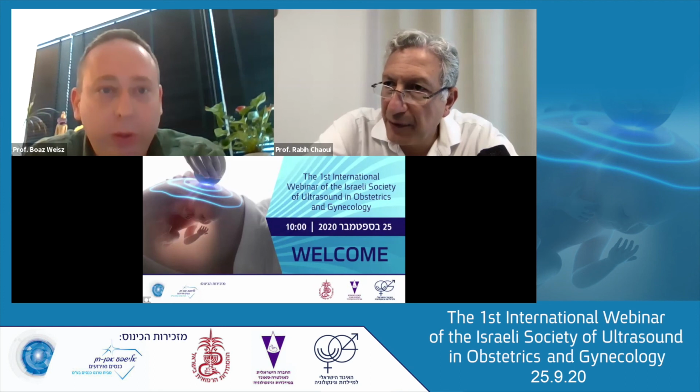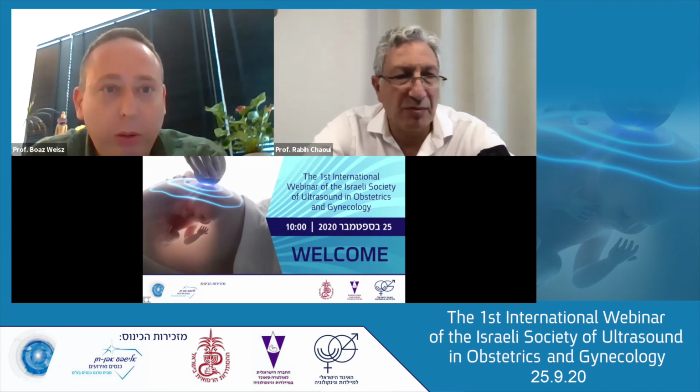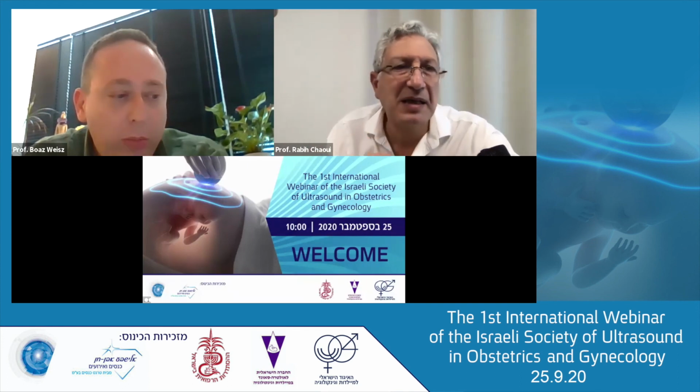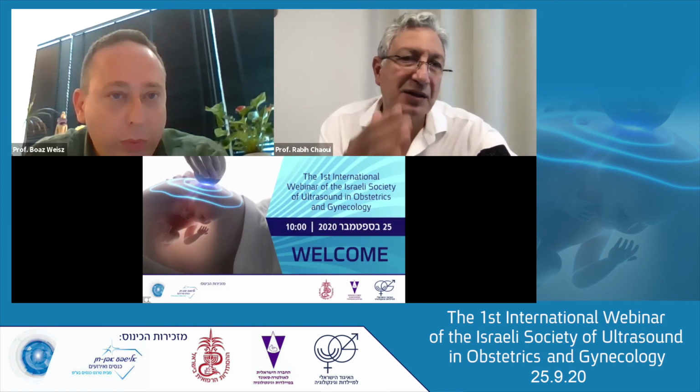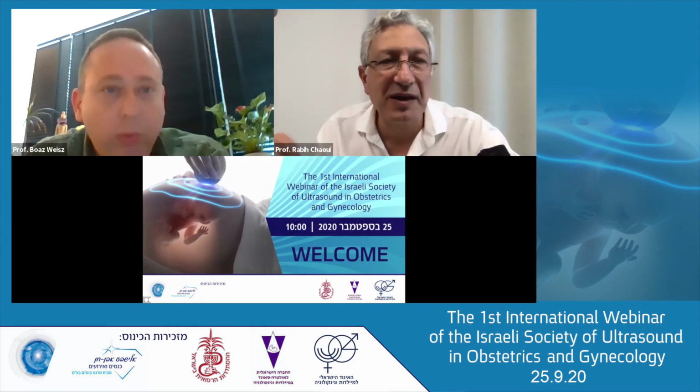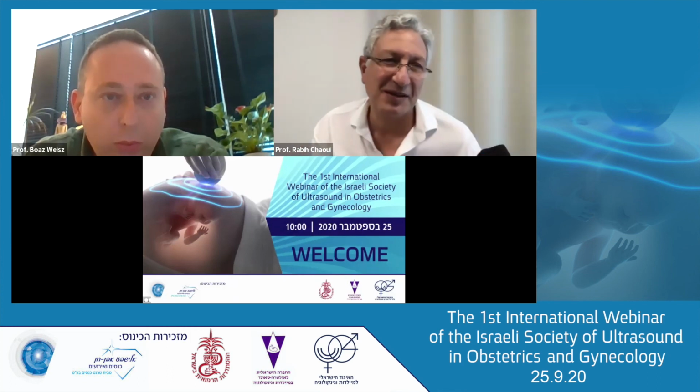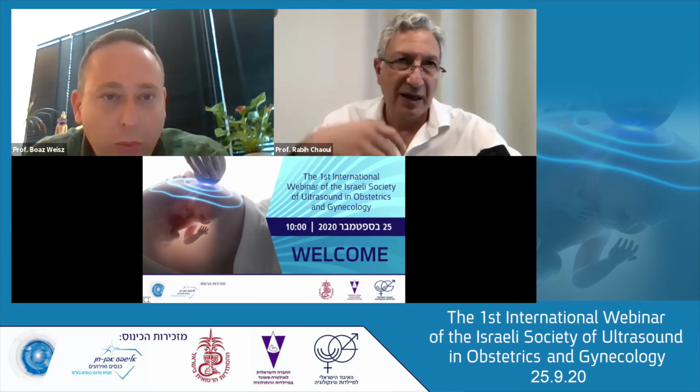First of all, if you are using high-resolution machines, you always see the azygos. The azygos is actually there. By the way, the name azygos means the unique vessel. Zygos is like twin; azygos is not twin. Because there is one on the other side, they call it hemiazygos, but it is not going the higher way.